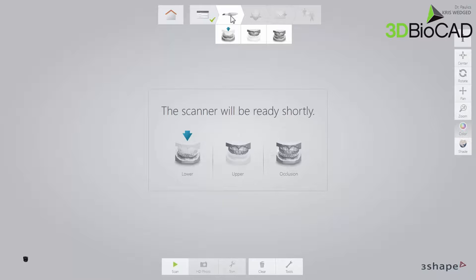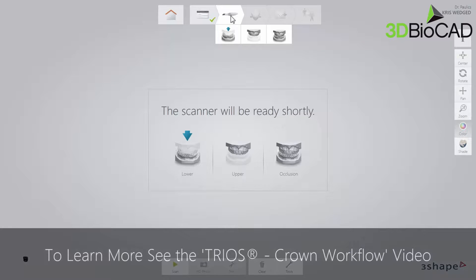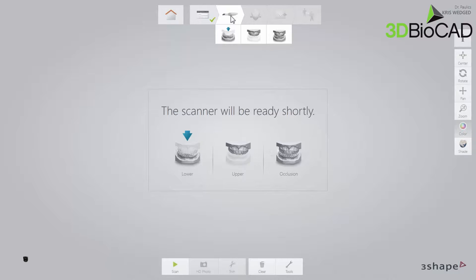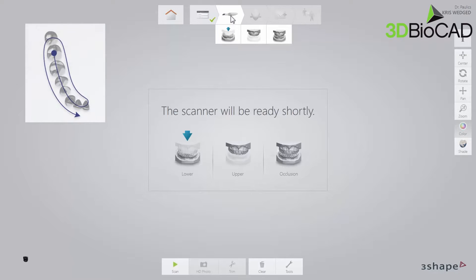In this case, start by scanning the opposing arch to allow time for the retraction methods to take effect. We start by scanning the lower arch. For cases where parts of the margin are below the gingiva, follow one of the two scanning options outlined in the crown video. In this particular case, there are no parts of the margin below the gingiva, so simply follow the official scan strategy.